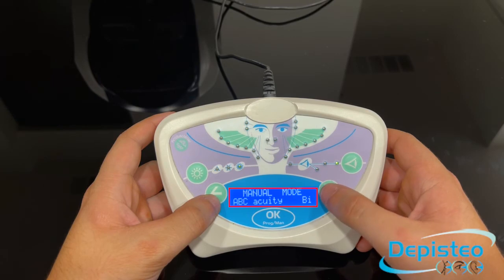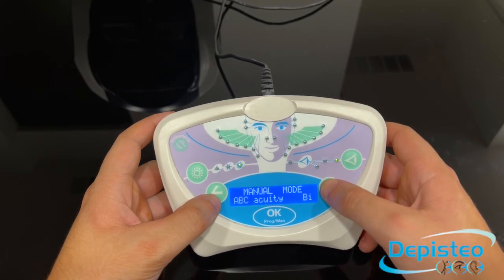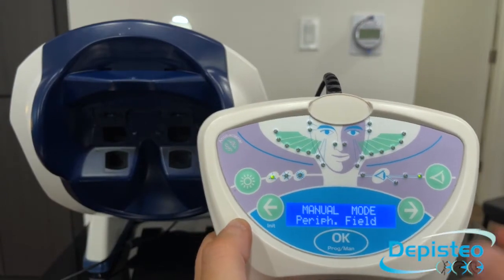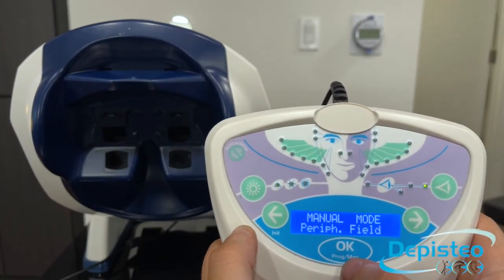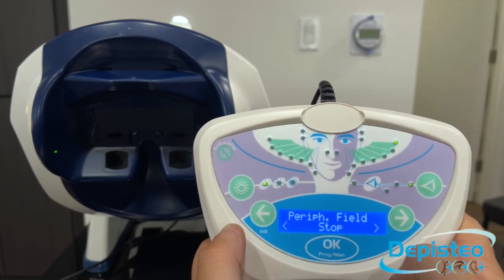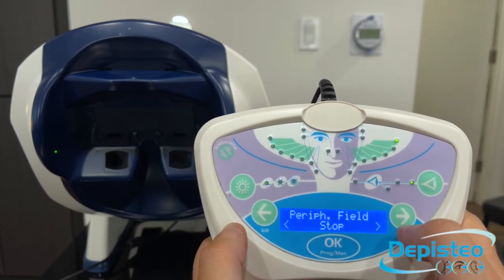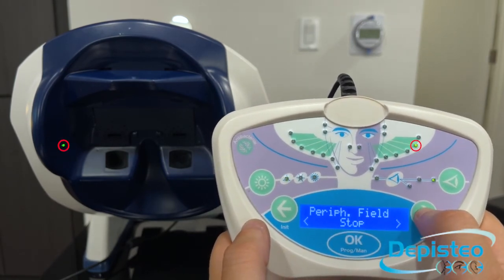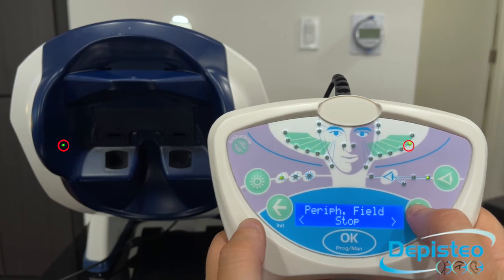You can cycle through tests using the left and right arrows. For the peripheral field test, you need to select that test and press on OK. The peripheral mask on the machine is going to come down and you can now start the test. The grid on top of your remote control is showing you what angle of peripheral vision you are currently testing.